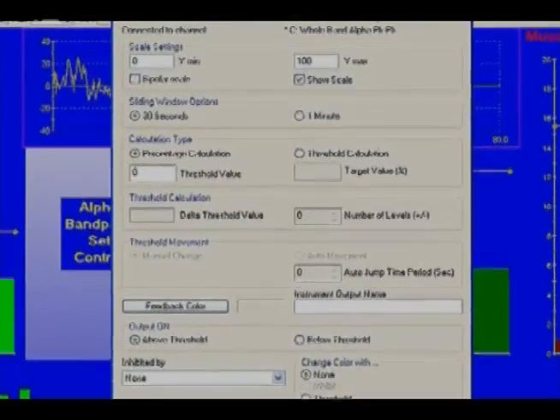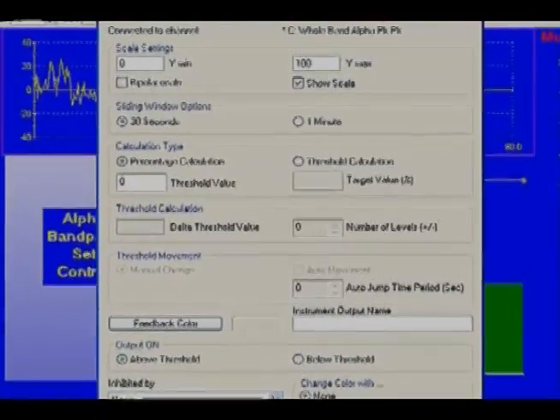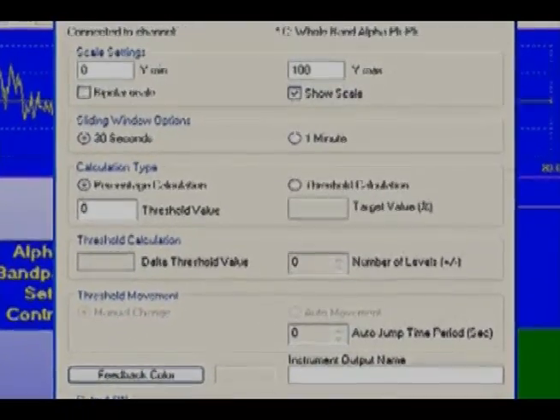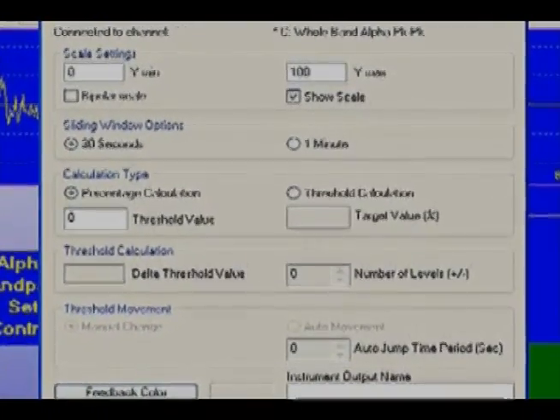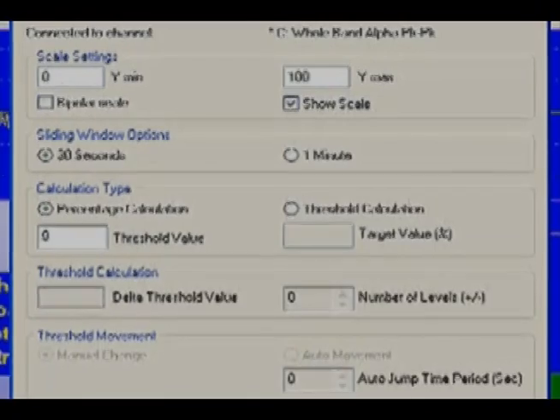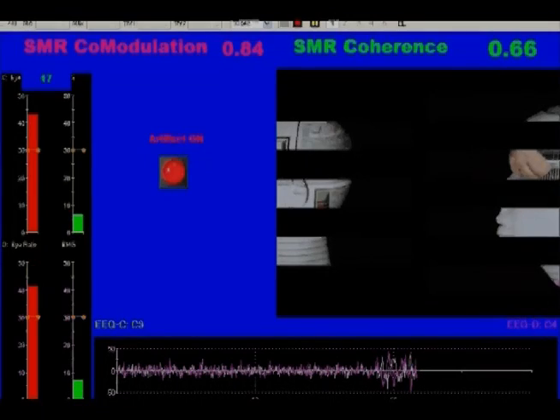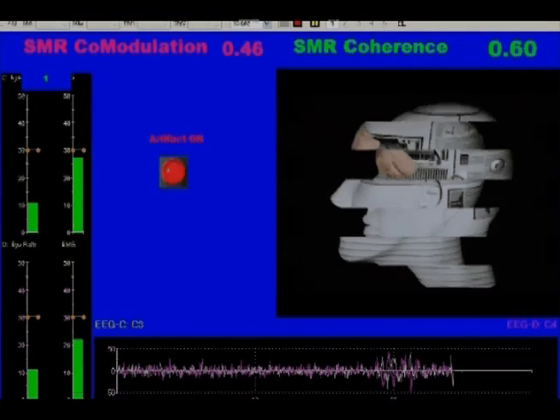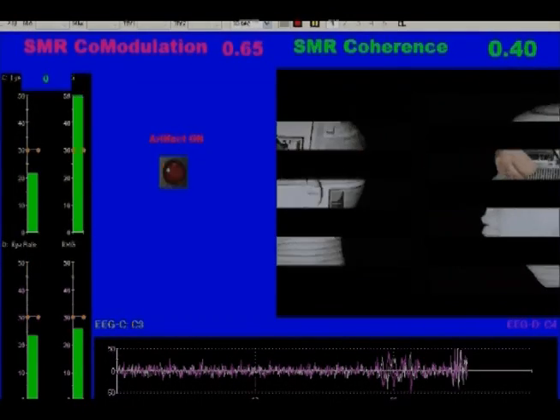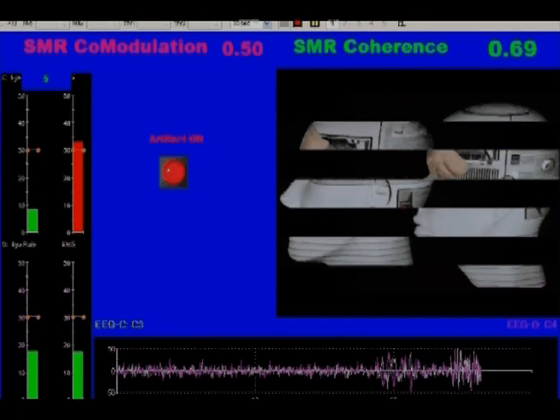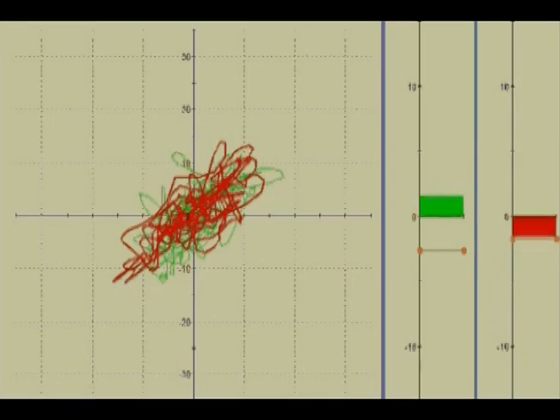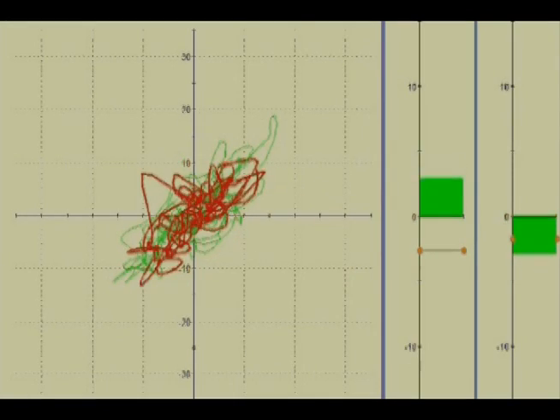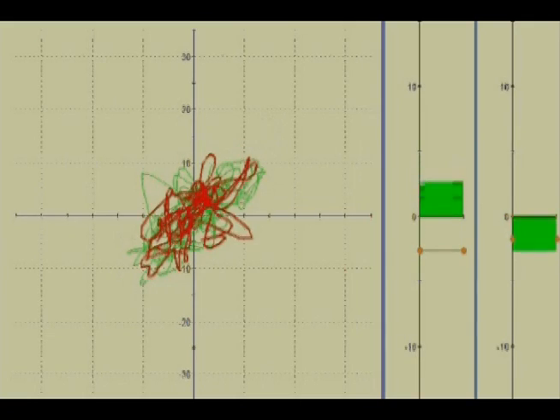This screen illustrates the different choices for threshold settings, including manual, automatic jump, toggle, and percentage of time above threshold. This screen shows feedback of coherence, co-modulation, target counters, and event markers. Here's an innovative screen which plots one signal against the other, creating a Lissajous-type pattern.